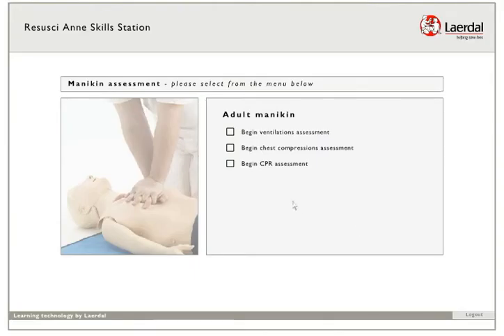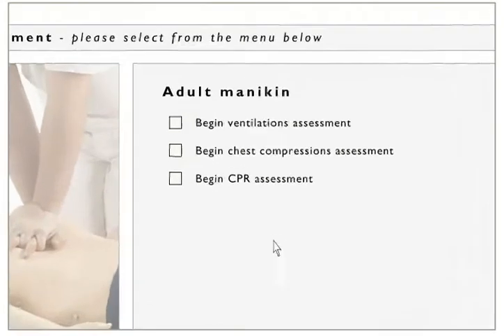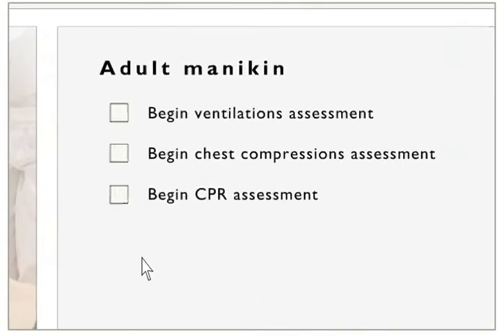First, you have to choose between the assessments. It is recommended that you select the assessments in the order they are listed. Each assessment begins with a short introduction. Start each assessment by clicking on the one you want to practice on.